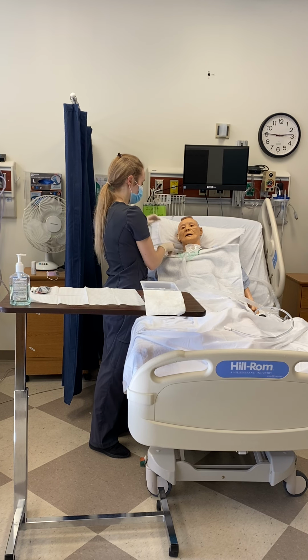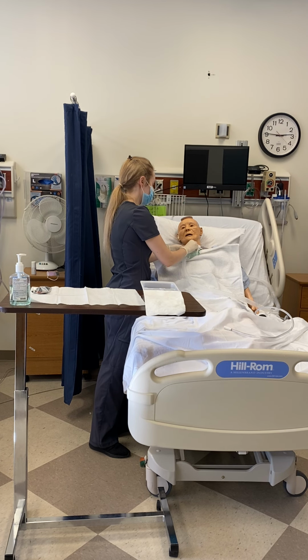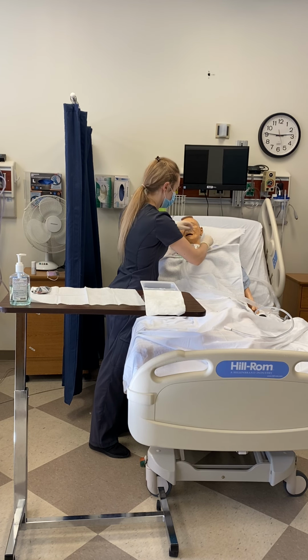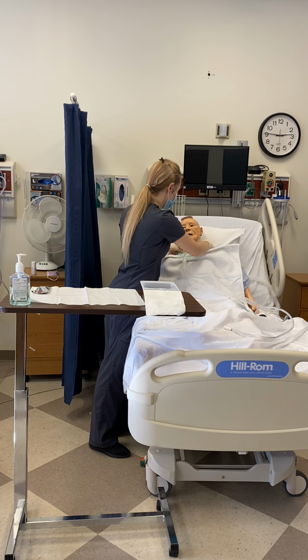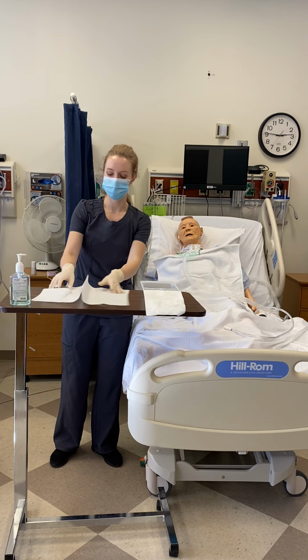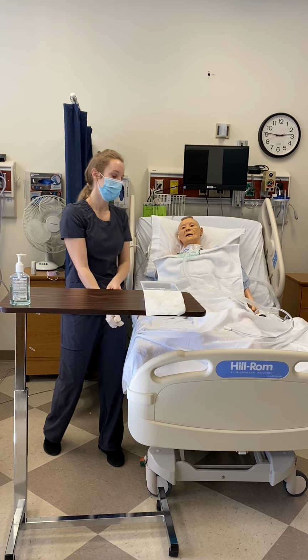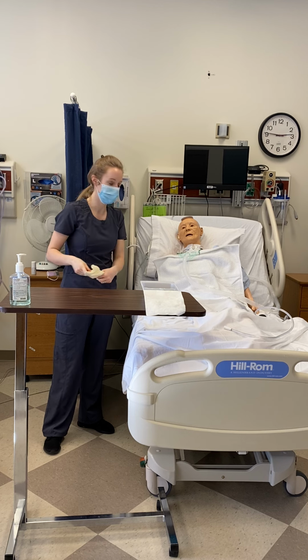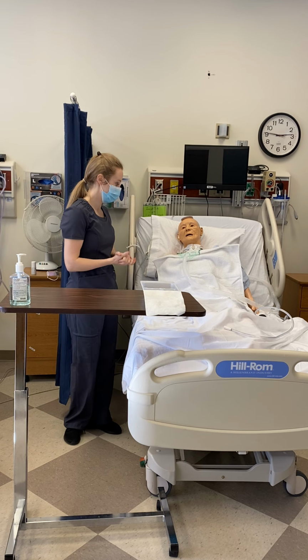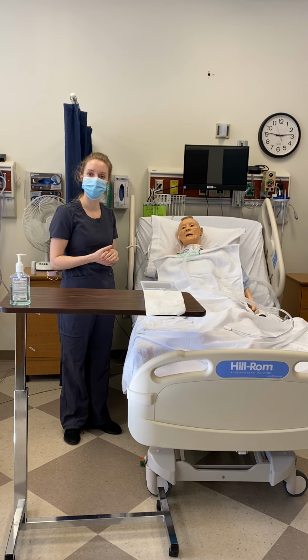And while I'm doing this, I'm assessing Mr. Smith. Maybe he needs to be oxygenated at this point. I want to make sure he's not having pain, he's not feeling a lot of pressure, anything like that. And I take this old bandage and I can just discard this, clean up my workstation here, discard my gloves, and then I want to document. I want to document what the original bandaging looked like, what the tracheostomy site looked like, how Mr. Smith tolerated the procedure, the type of catheter that was used, and then his respiration status before and after.